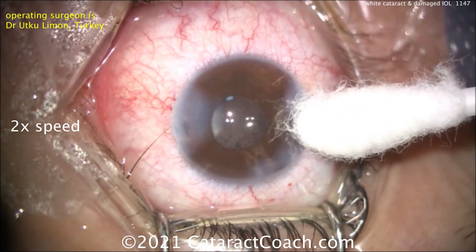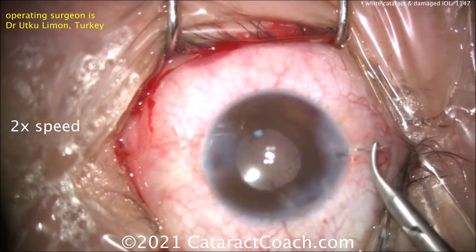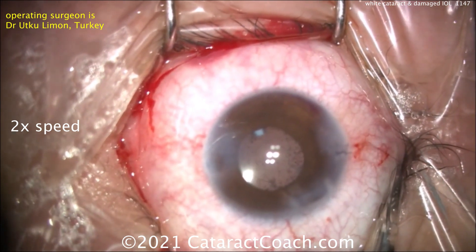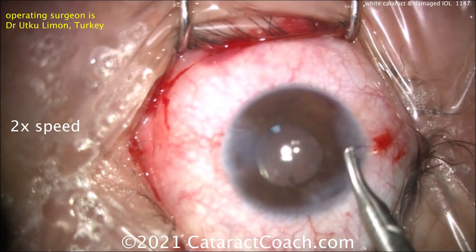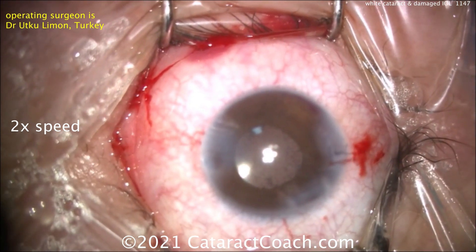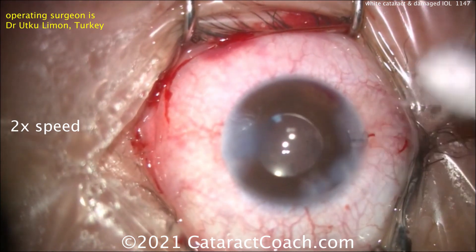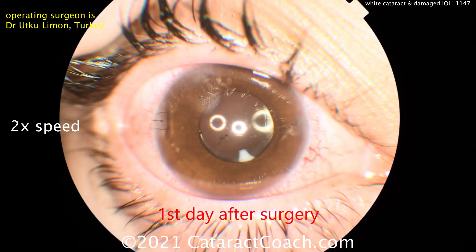So, an interesting case — we learned a lot from this one. Number one: needle decompression. Number two: using a cystotome, micro scissors, or MVR blade to cut through fibrotic bands to complete the capsulorhexis. Number three: performing a posterior capsulorhexis. Number four: if the lens is incorrectly loaded, do the IOL exchange with the twist-and-out procedure. And finally, make sure the incision is sealed well — use sutures or even a bandage contact lens for a nice result.